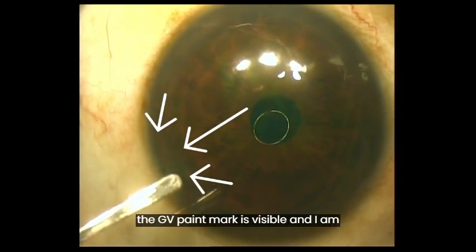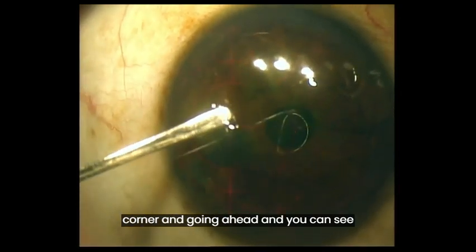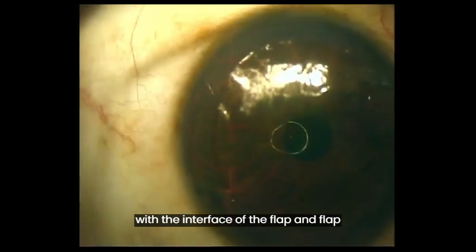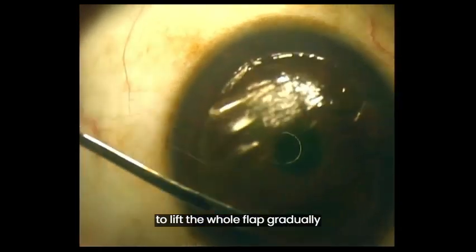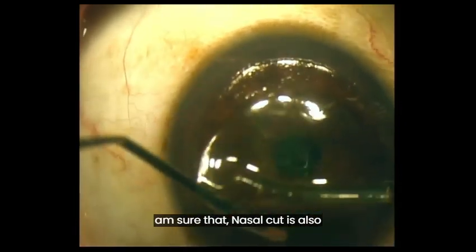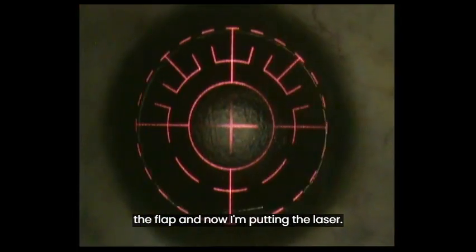You can see here the GV paint mark is visible, and I am pushing the spatula just anterior to the GV paint mark, just pressing the cornea and going ahead. You can see the spatula has automatically negotiated with the interface of the flap and the flap has been lifted so easily. I am lifting the whole flap gradually because I am not sure whether it is a nasally hinged or superiorly hinged flap. Going gradually, once I confirm the nasal cut is also there, I am now sure the hinge is definitely superiorly placed. I have lifted the flap and now I am applying the laser.